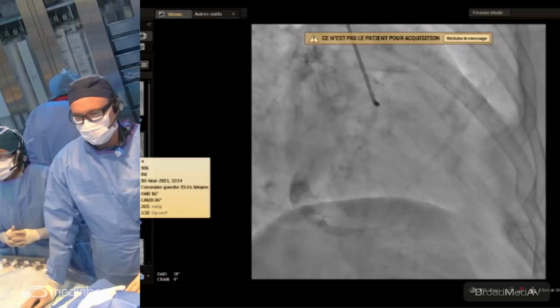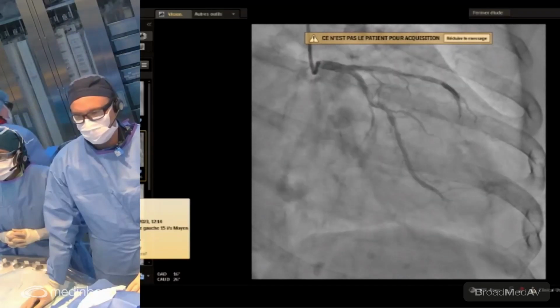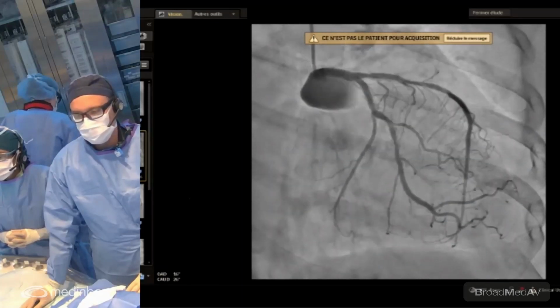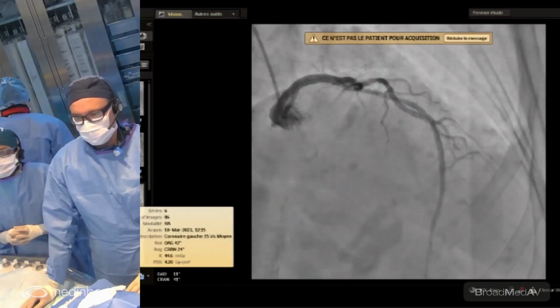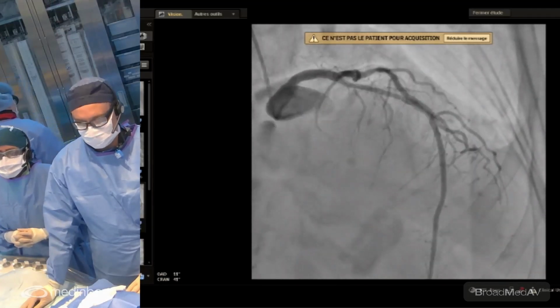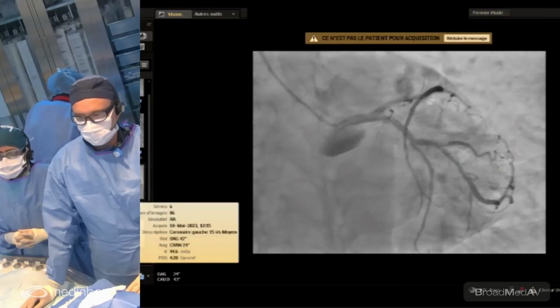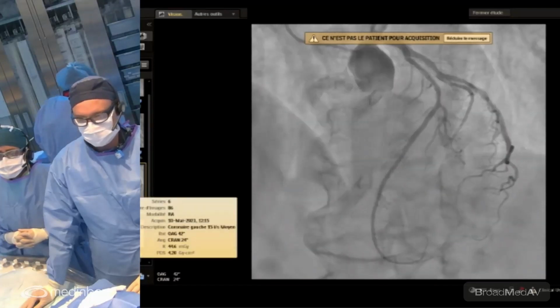Okay. Can you show the left? Perfect. So the left main and the circ are free of disease. We can see there was some calcification with only less than 30% stenosis of the marginal. Next, can you show this one? The mid to distal LAD looks fine, but there's some calcification, and we had doubt on the proximal LAD here. Can you show the next slide? Here you see it's grayish, a little bit hazy on the proximal LAD, so we had a doubt on this. Can you show the last one, please?